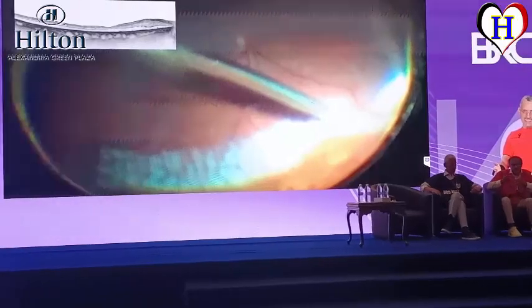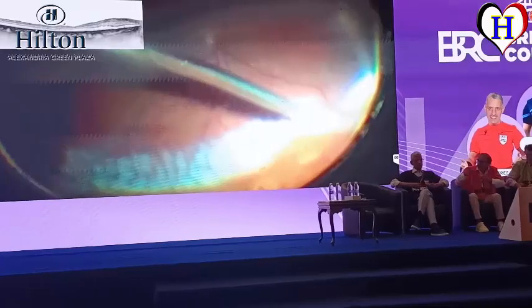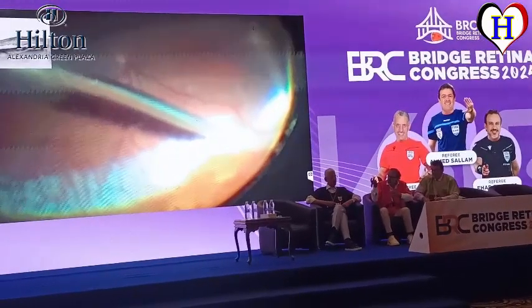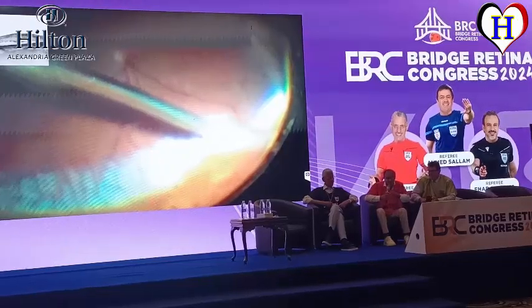And if it's so peripheral, do indentation so you can see the tissues that you're cutting at the time. And of course, some people like the cutter, but the cutter usually cuts a lot of retina. You can use the scissor. The force of the vertical scissor, you always press it directly, so this pressure can cause the lower blade to hit the choroid, not touch the cutting blade. But an excellent case and very well managed at the end.